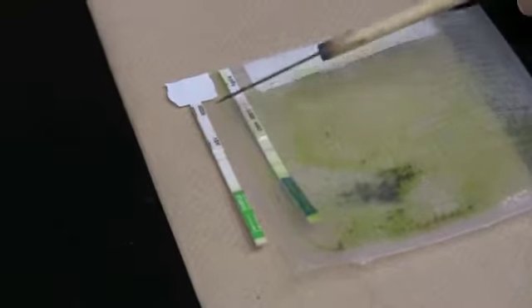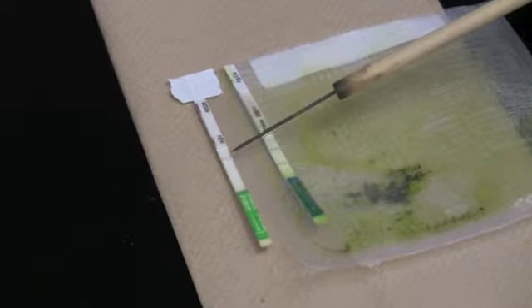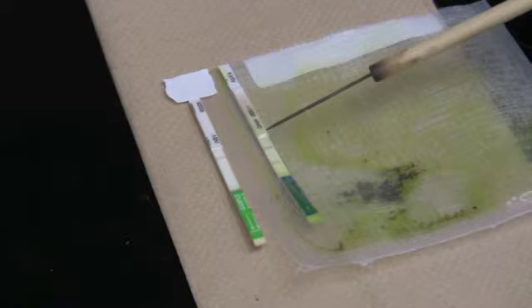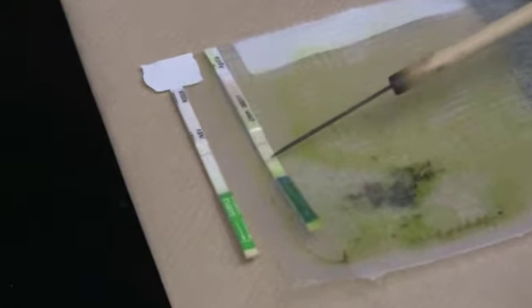So Bob, I've laid over on this side a negative test result so that you can see the difference. Here again is the control line, but in this case there was no reaction to the presence of bacteria, which tells us that this sample was negative. Tests like this are available commercially, and any grower can buy this kind of testing material and test their own plants in the field should they so desire.